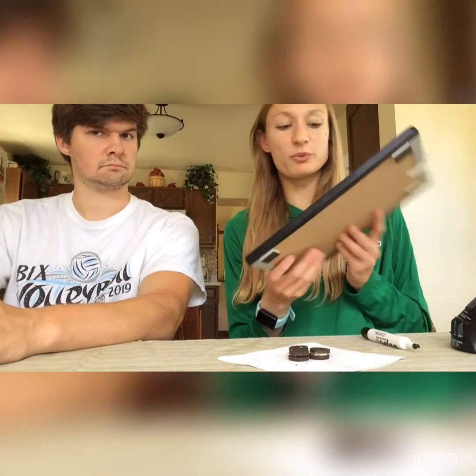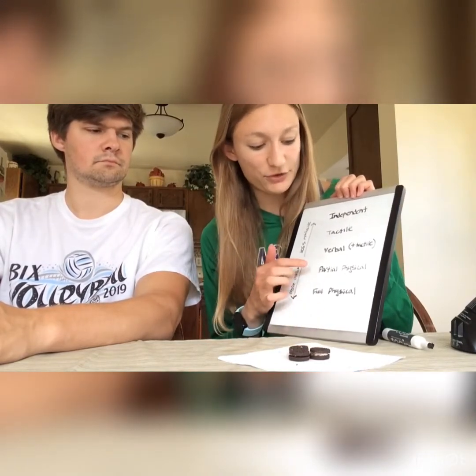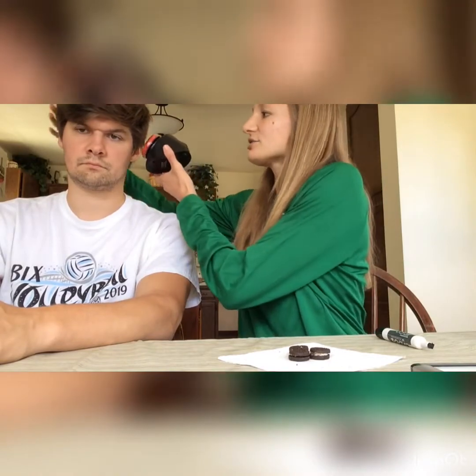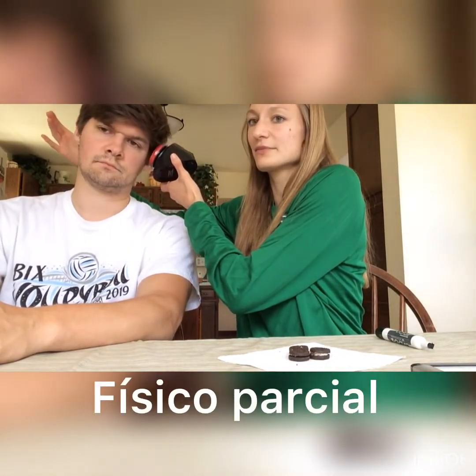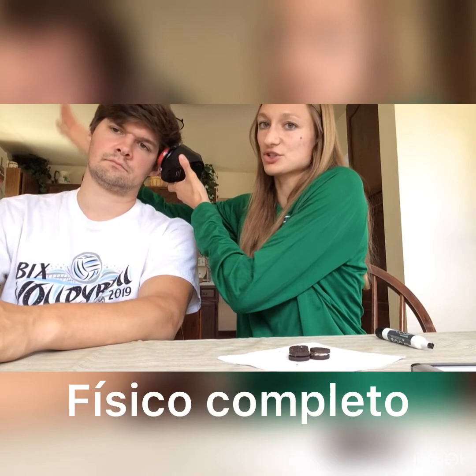So then if we get to the point where independent, tactile, and verbal, and they haven't answered us yet, and we know it's an item that they want, I'll move to partial physical and full physical. So those are similar to what we did with our hands, but instead we're using their head. So I would just gently nudge them towards it for a partial physical. And if they still don't hit it with a partial physical, then I'll gently move their head towards the switch. And that would be a full physical prompt.